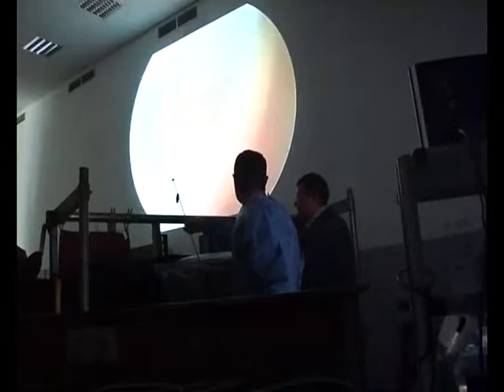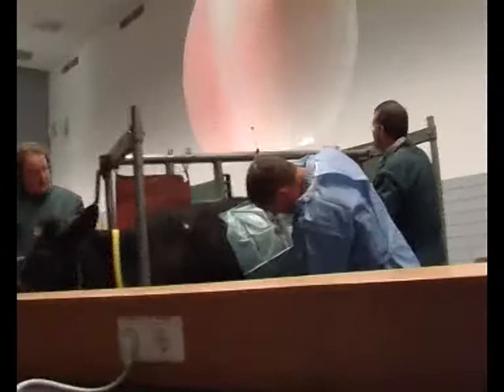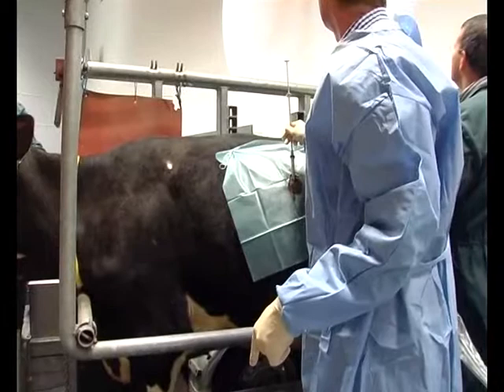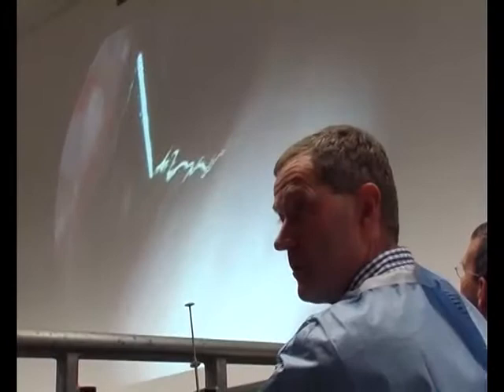What I can do, yeah, you can switch on the light now. I don't think you will reach the... What I can do is just leave the applicator without any force, and as you see, it sinks down, and I can see it is in this area here, and it goes down quite easy. And because of the bending, it's to the other side. And you feel the discomfort on the... No. There. And this is the trocar, and inside the trocar is the applicator.